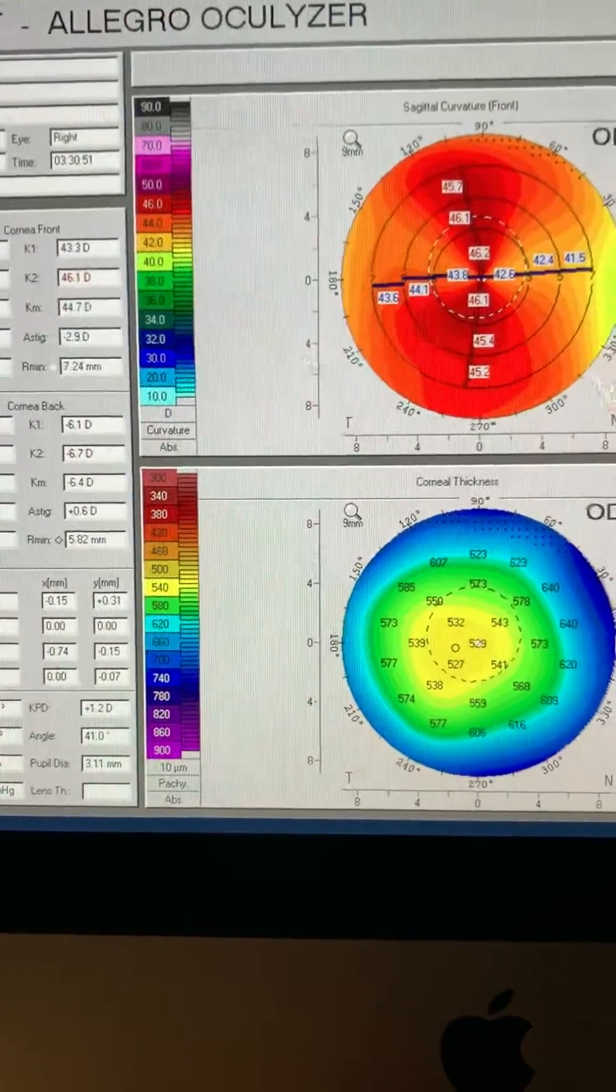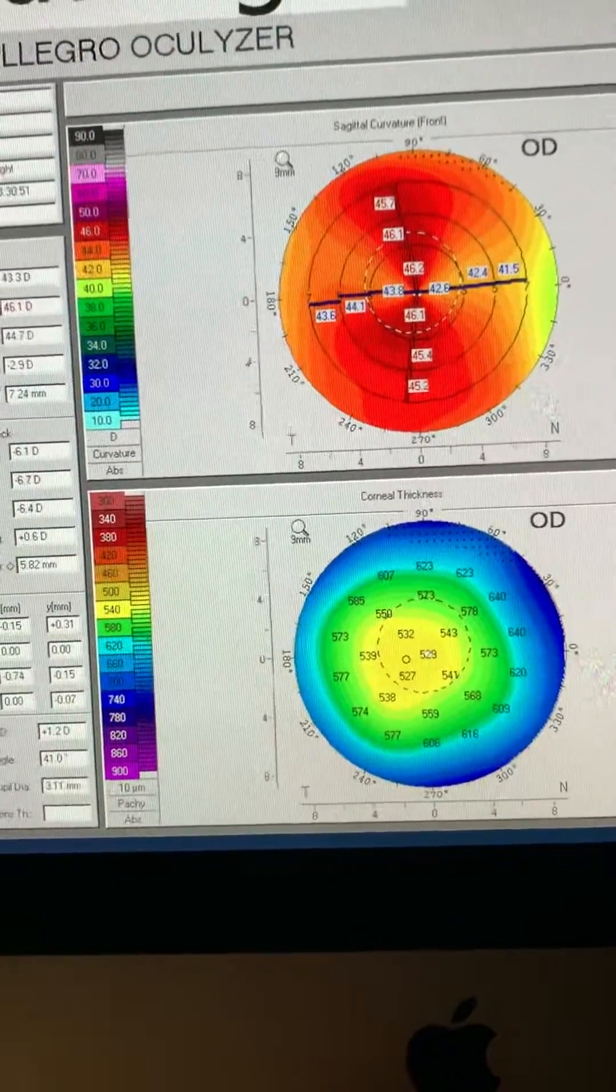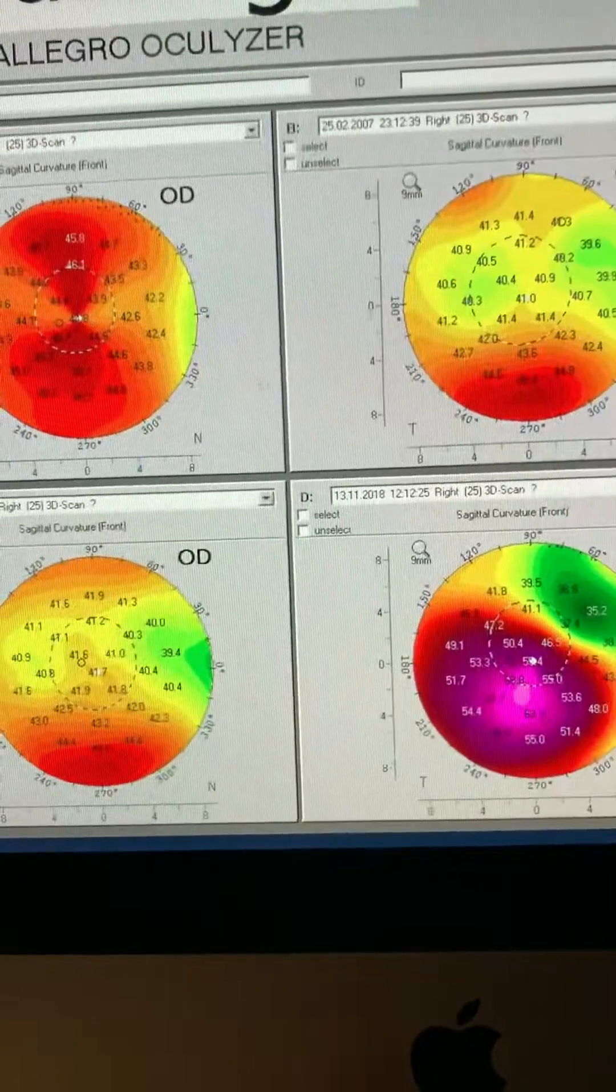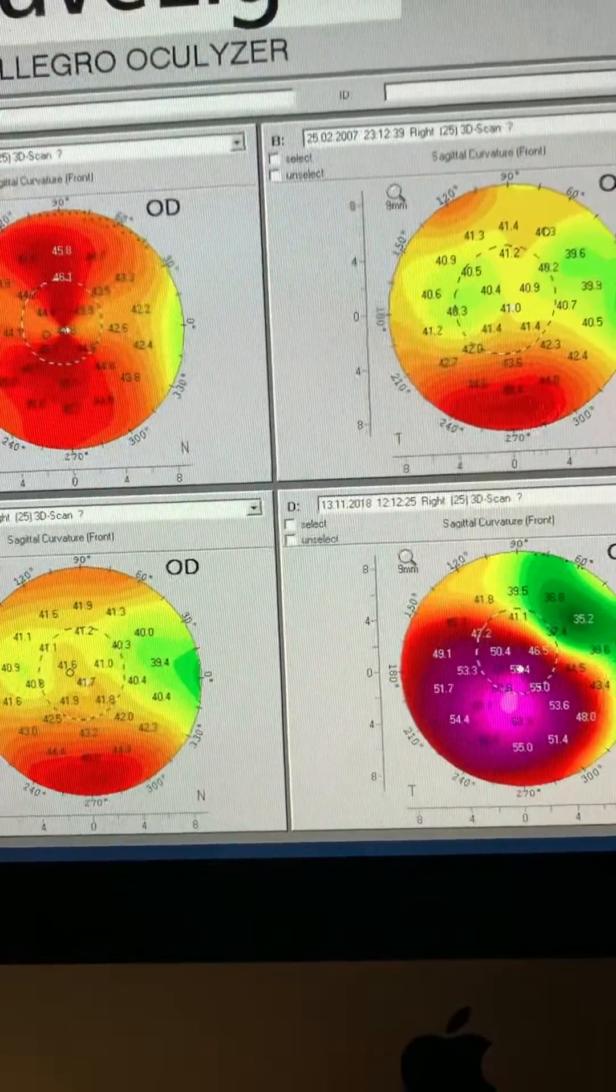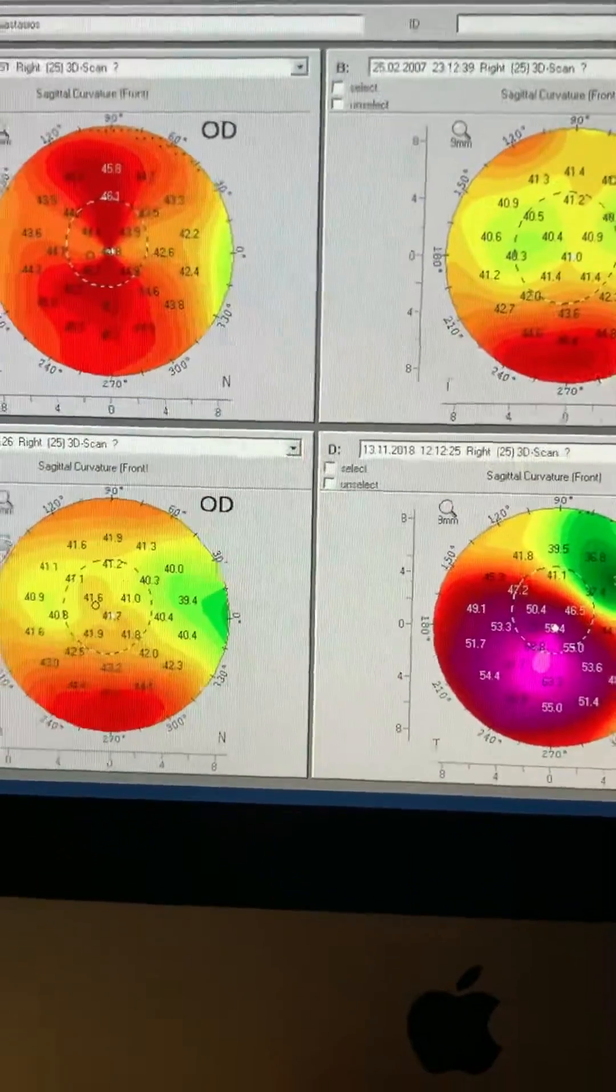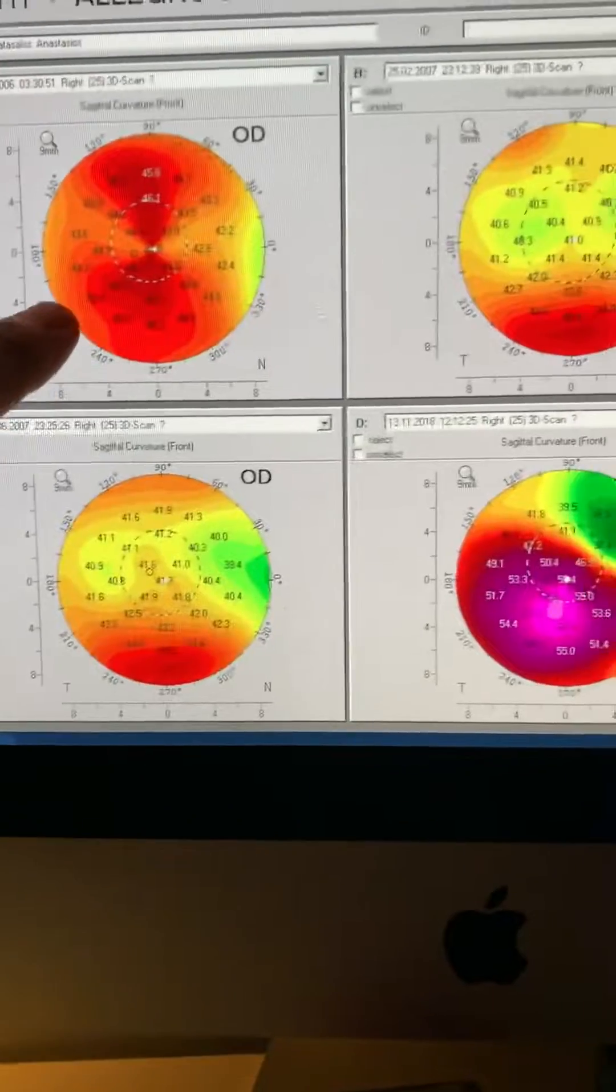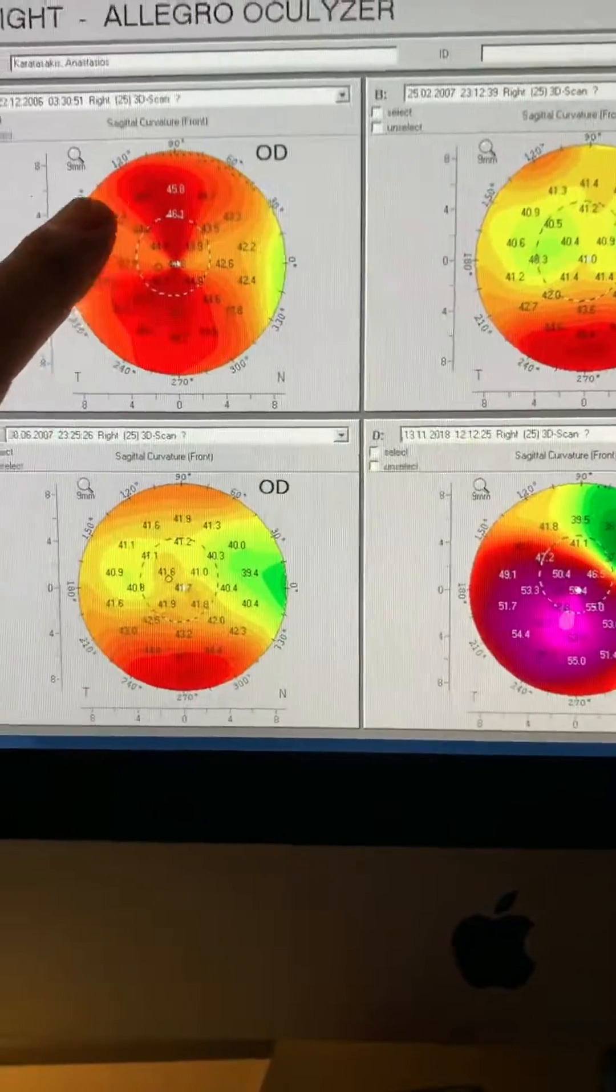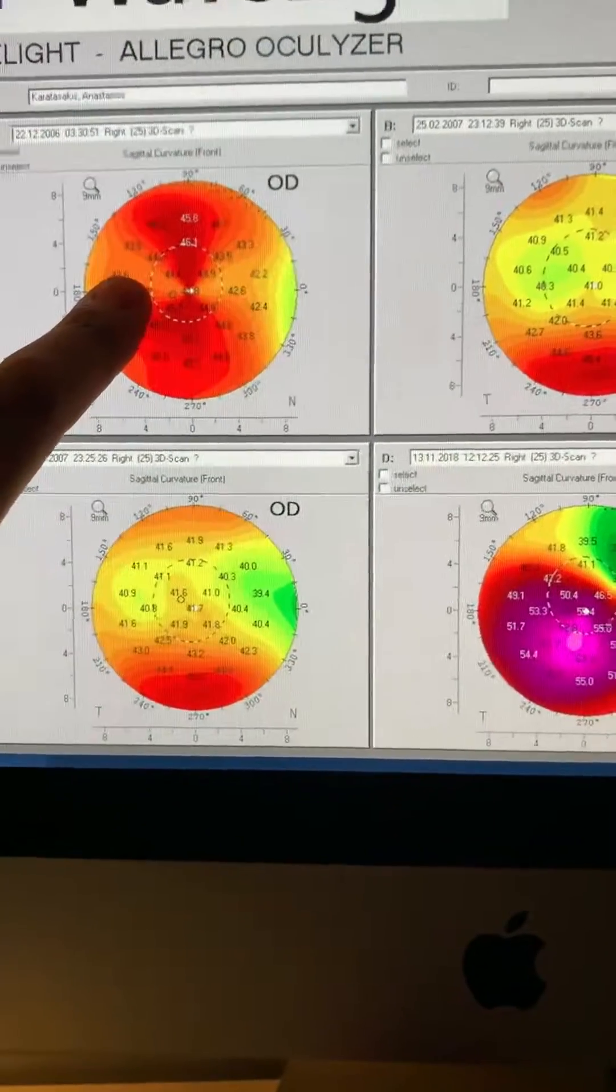And we'll see sequential topographies of the patient. He is an eye rubber, and he noticed since 2006, 12 years now, changes developing. We're here in 2006 prior to the procedure.